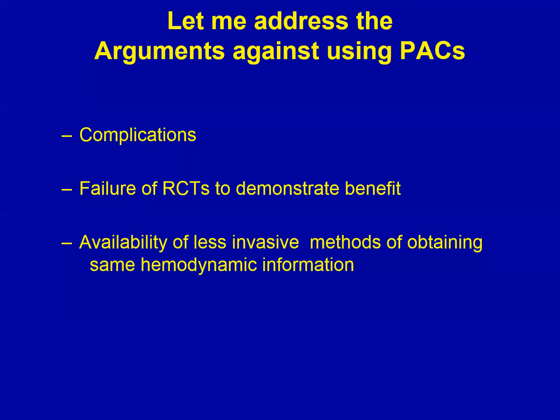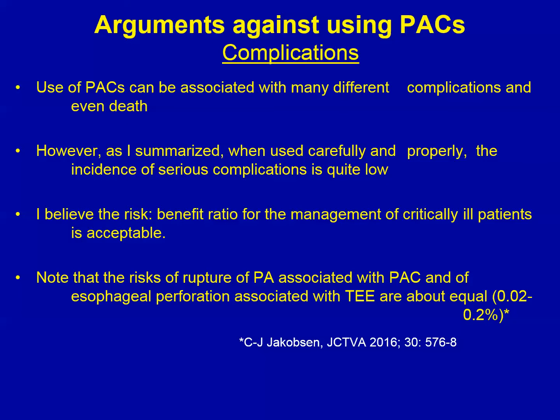Let me address the arguments against using pulmonary artery catheters. They are mainly 3: complications, failure to demonstrate benefit, and availability of less invasive methods. I have already addressed the issue of complications. Although PA catheters can be associated with many different complications and even death, when used carefully and properly, the incidence of serious complications is very low. And I believe the risk-benefit ratio for the management of critically ill patients is acceptable.